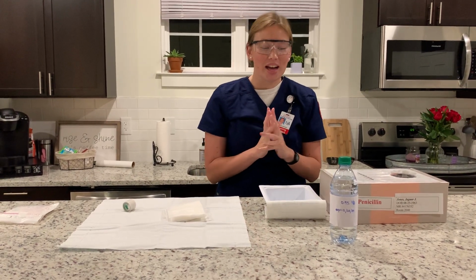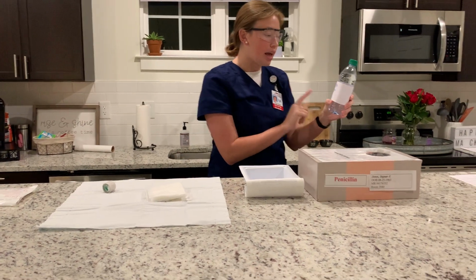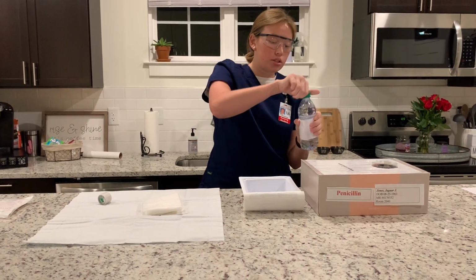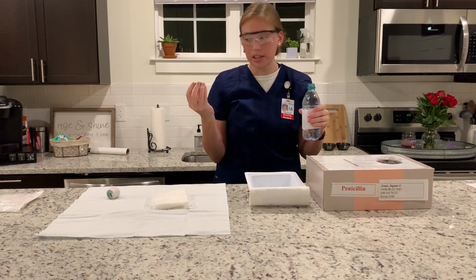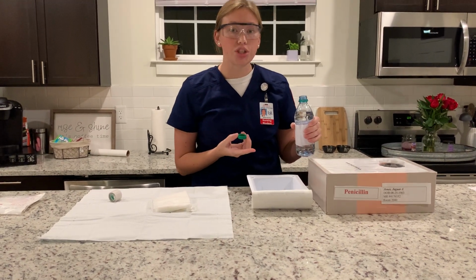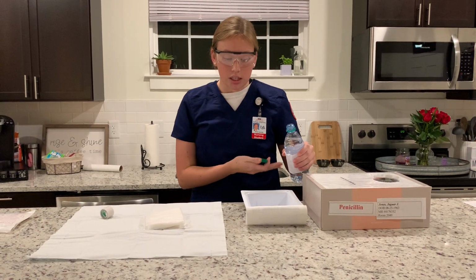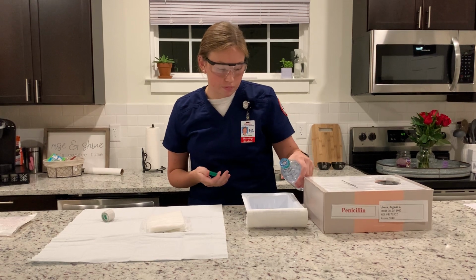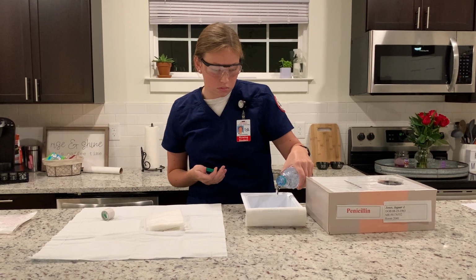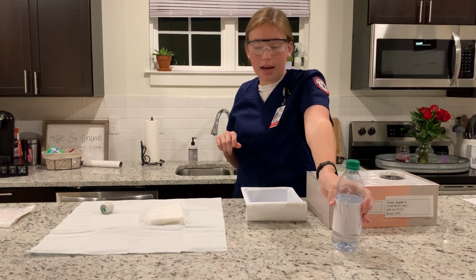Now I am going to pour my saline, and I'm going to note the expiration date of it, and it's not expired. I will then palm the label and unscrew the cap and then leave the cap upwards. I will pour saline into the basin, but make sure that I do not have any splashes to my sterile field or that the containers don't touch. Okay. Screw the cap back on, and I'll put it to the side.